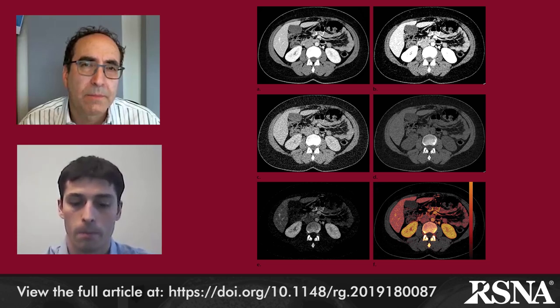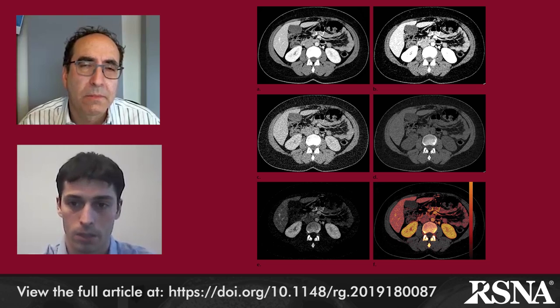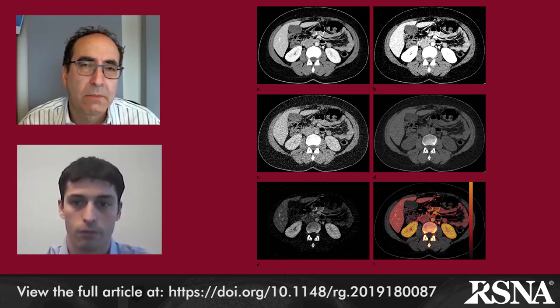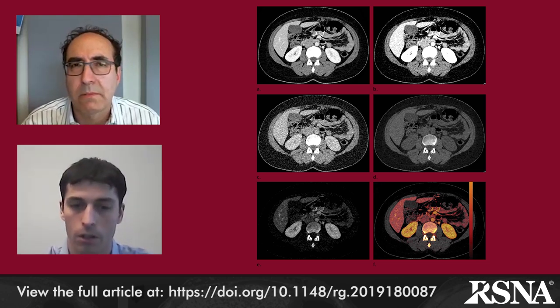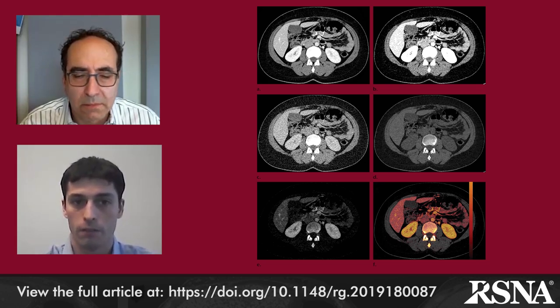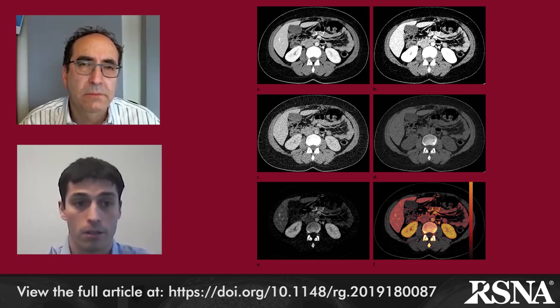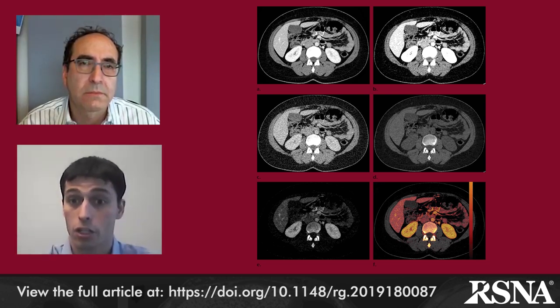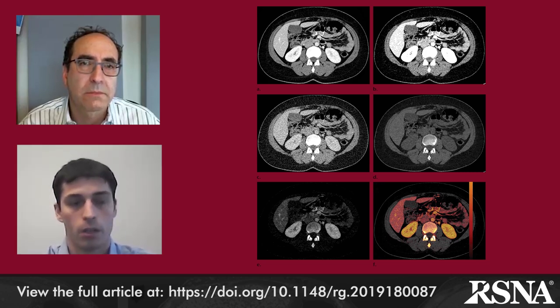This allows increasing the spectral separation of different body constituents, since every single body constituent or chemical element will have its own signature and will interact differently at different energy levels. The attenuation of these body constituents is KV dependent, or energy dependent. If we look at Figure 2, the first image represents the normal or conventional image you would get as if you were imaging a patient using a 120 KV regular conventional CT of the abdomen. This image represents blending of the high KV and low KV datasets to recreate a conventional CT — the type of image you will get in your PACS system to review the case.